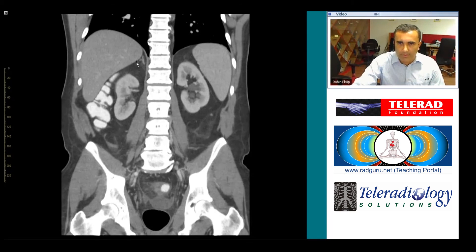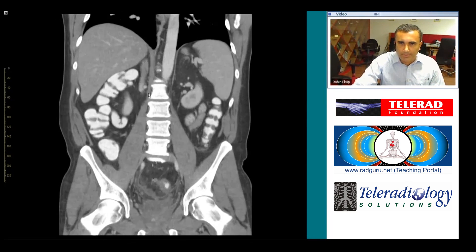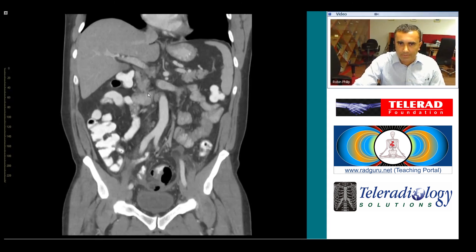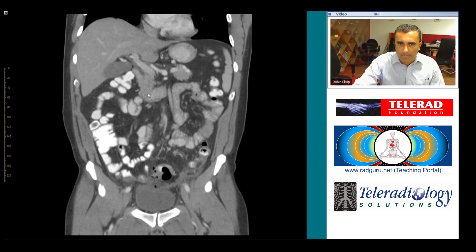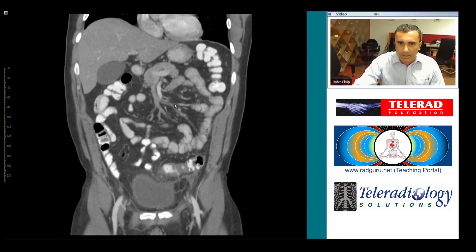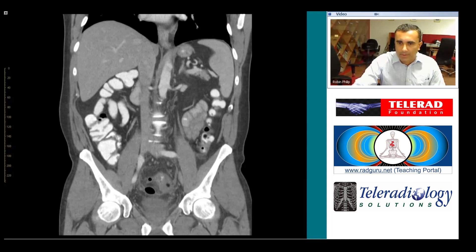There is a loculus of free air up under the liver. Perforated sigmoid diverticulitis with abscesses and free intraperitoneal air. Thank you.